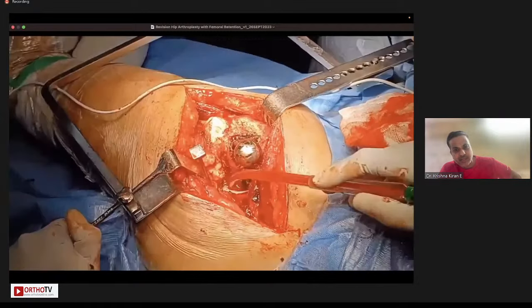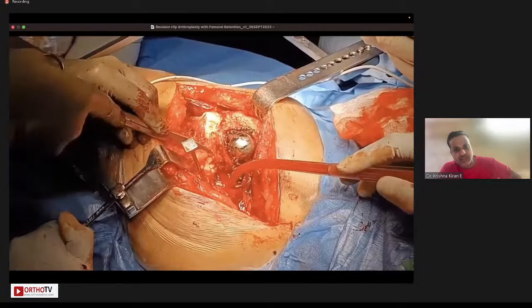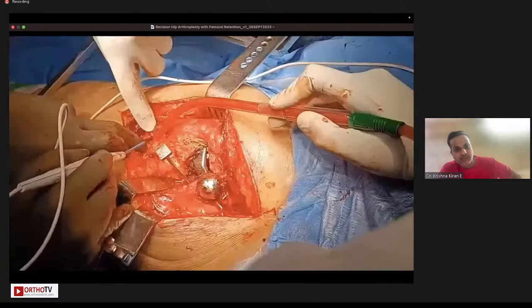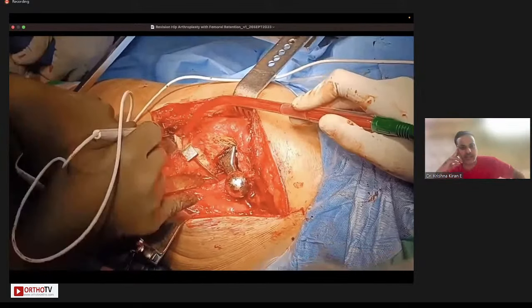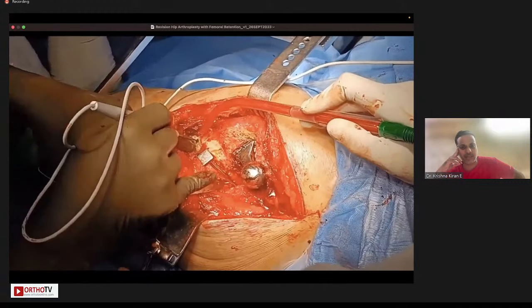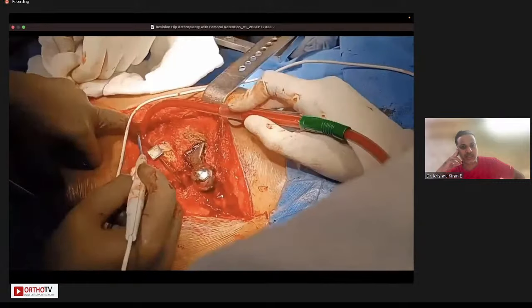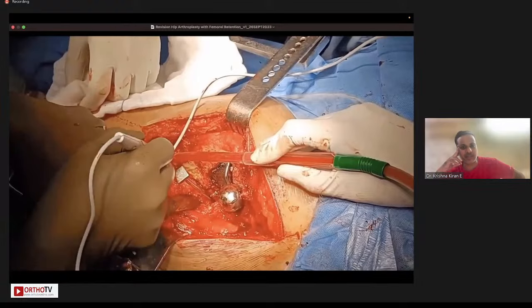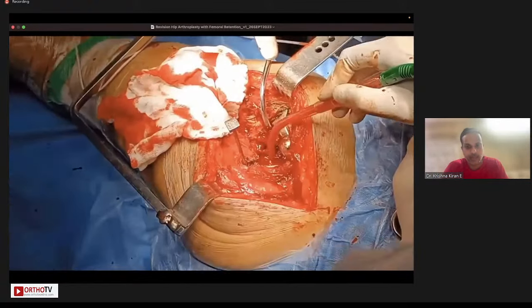And as I am dissecting and releasing the anterior capsule using these chicken scissors, you can see my assistant is able to more and more internally rotate the femoral component. Now the third component of release is the adductor magnus release, which is not very well described. But this adductor magnus can be identified about 3 centimeters below the level of the lesser trochanter. And you can see that the second perforator comes in there. Once the adductor magnus is released, the femur can usually be internally rotated beyond 90.